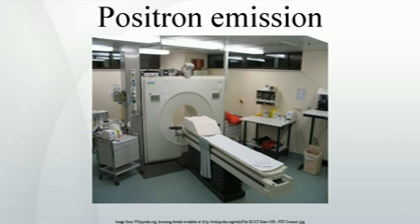Operation. To conduct the scan, a short-lived radioactive tracer isotope is injected into the living subject, usually into blood circulation. The tracer is chemically incorporated into a biologically active molecule. There is a waiting period while the active molecule becomes concentrated in tissues of interest. Then the subject is placed in the imaging scanner. The molecule most commonly used for this purpose is fluorodeoxyglucose, FDG, a sugar, for which the waiting period is typically an hour. During the scan, a record of tissue concentration is made as the tracer decays.